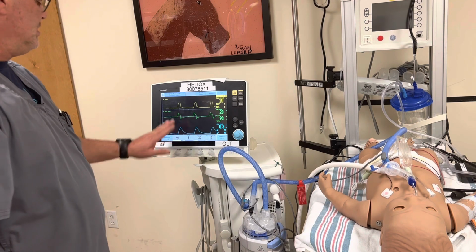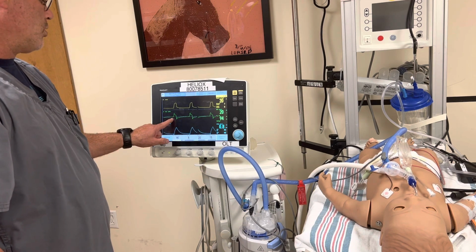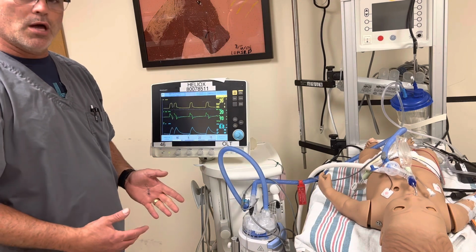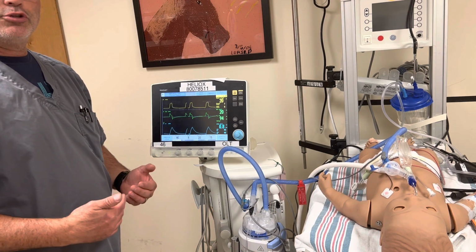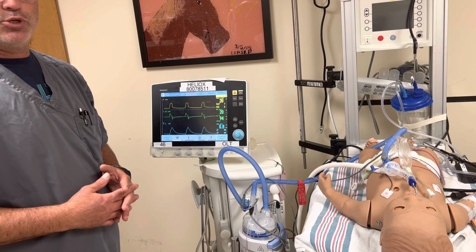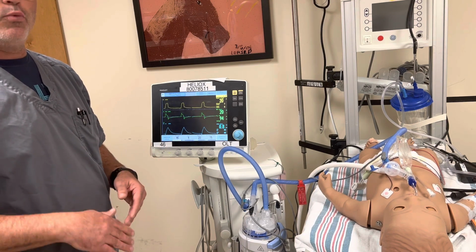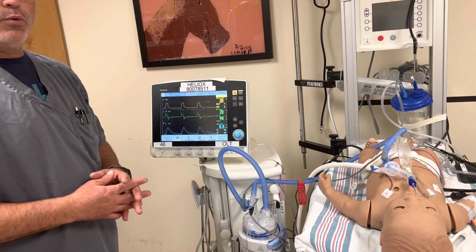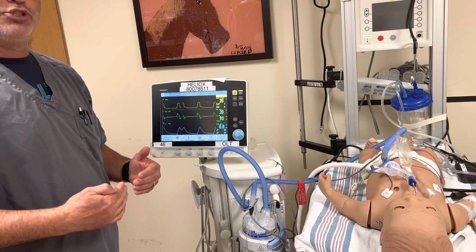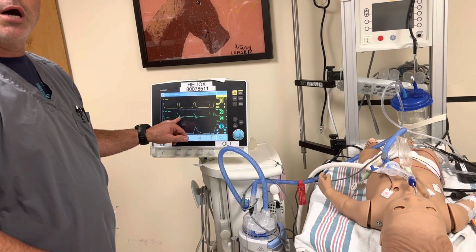So now the next step is to look at my I time. I need to set my I time to where my waveform on my flow scalar in the middle here gets to 0 flow. And when we talk about 0 flow, that term is always referred to in the inspiratory cycle here. It's never referred to as during the expiratory phase. So some people get inspiratory 0 flow confused with, is the expiratory flow reaching 0 on expiration? That's not what we use as our terminology here. If we're asking, are we getting to 0 flow, they're referring to the inspiratory phase. Is the inspiratory flow coming to 0 on inspiration?